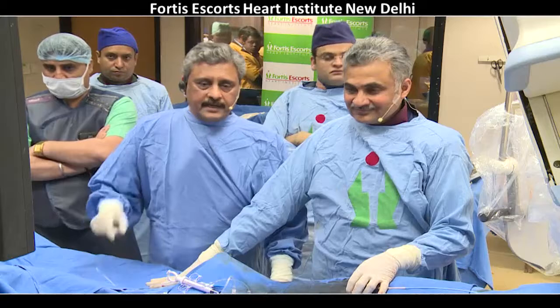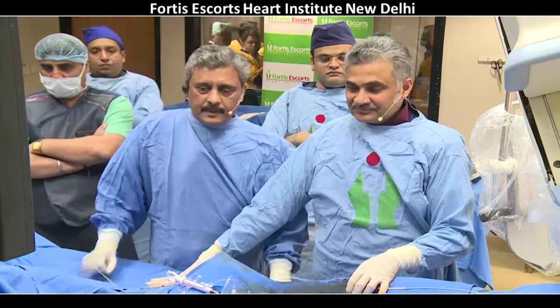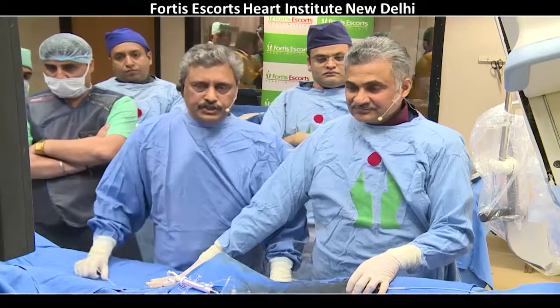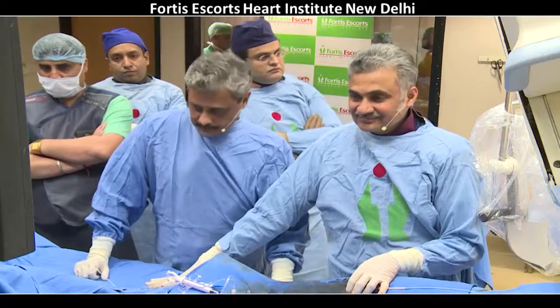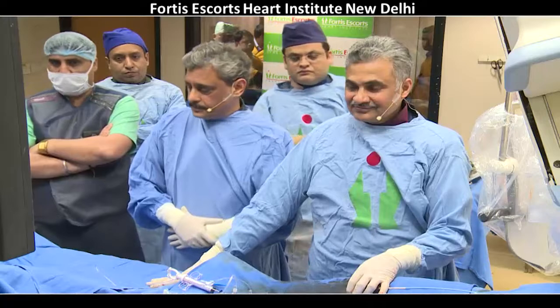Atul and Praveer, here this is a classical teaching case. You see the balloon was melon seeding forward and backward, causing an injury to the proximal and distal beds. But let me take you one step back. Why not bypass surgery?